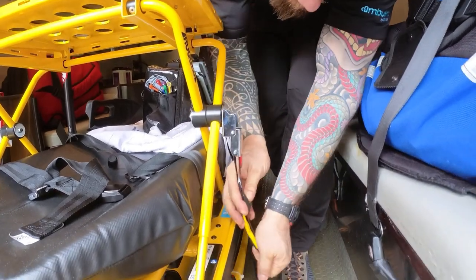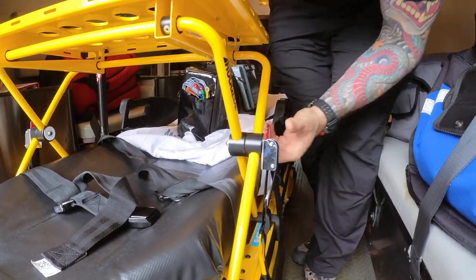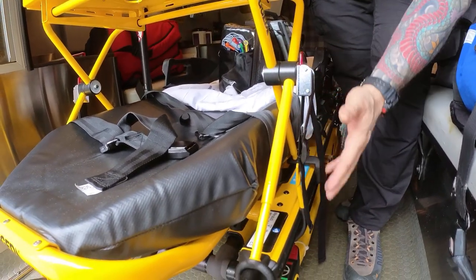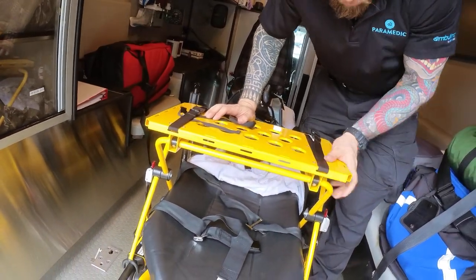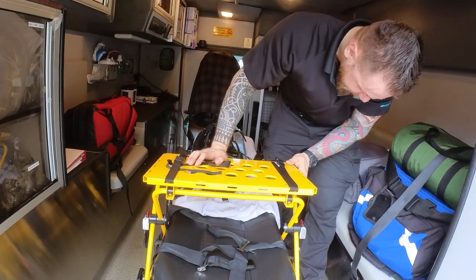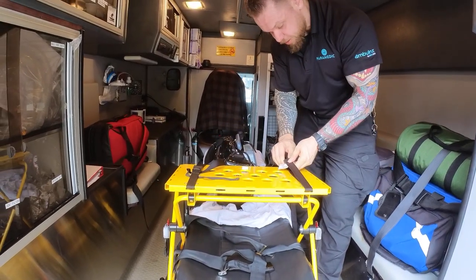Now I'm under and I'm going to find the red tab. I want to make sure I get the audible click. Before you start putting your equipment on, you just want to make sure it's secured nice and snug — everything looks good.